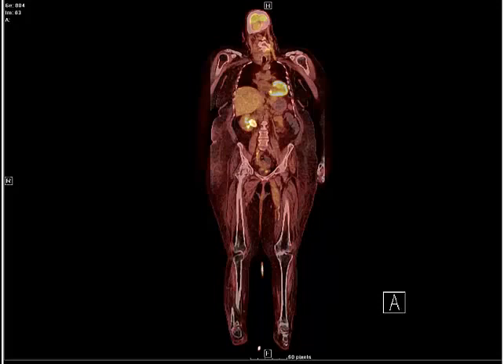We inject them on the floor so they're allowed to rest in their bed. We do instruct our nursing staff on radiation safety and what to do with these urine bags, because you do have to be mindful. If you start doing infection imaging on these very sick inpatients, this bag of urine will be very, very hot. We are injecting them with FDG, so we instruct them.